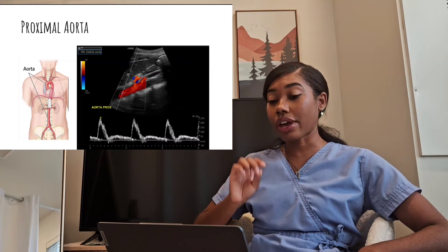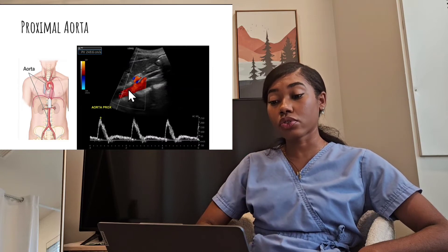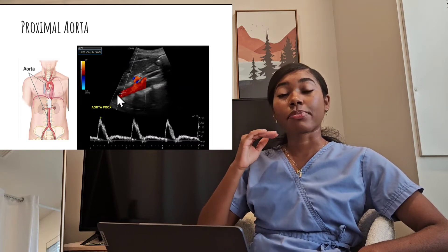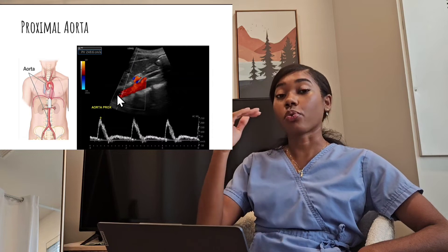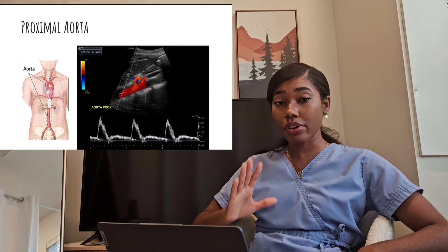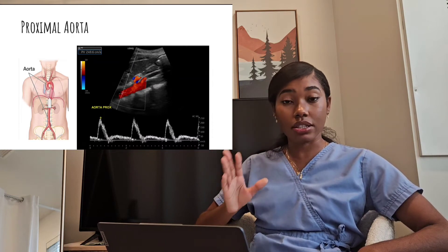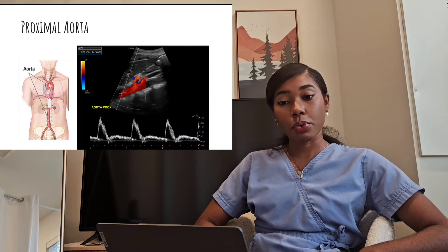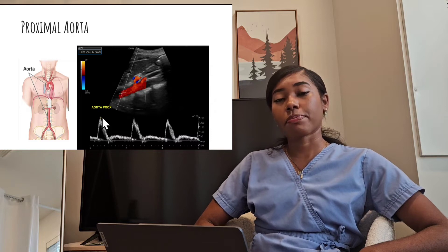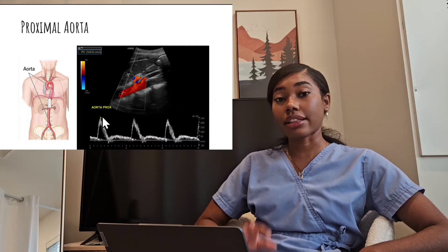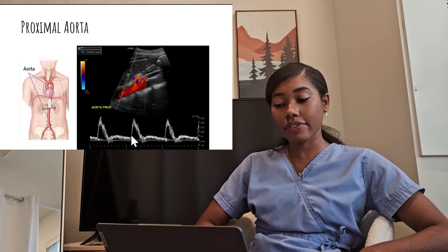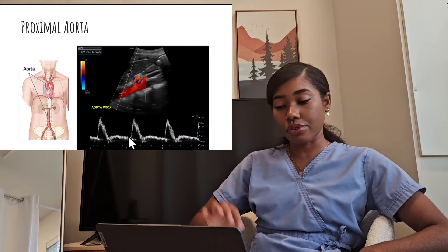You want to make sure that your angle is correct and that the angle is parallel to the walls of the vessel, as parallel as you can possibly get it. You want to measure the spectro-Doppler waveform with the peak velocity at the highest velocity. You can also measure the end-diastolic velocity if you like, just before the upstroke.